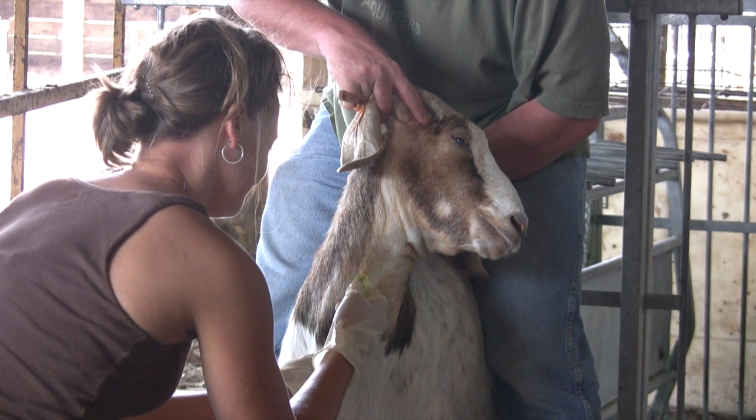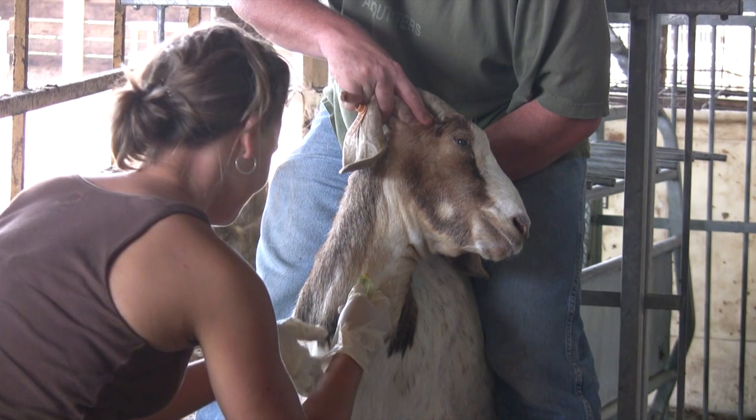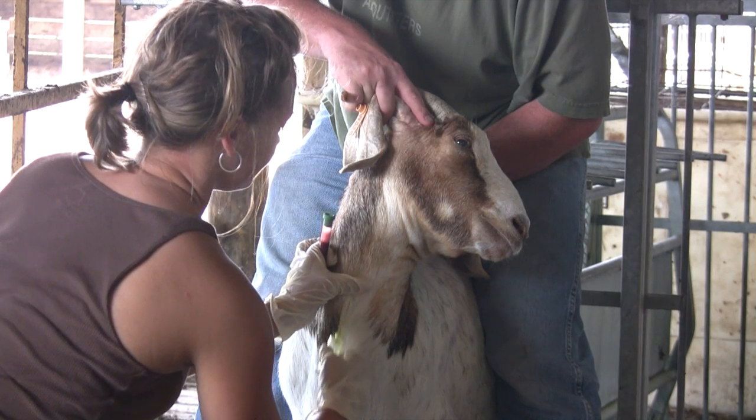Before removing the needle, be sure you remove your left hand, removing the pressure on the vein. Next, remove the vacutainer to prevent the loss of vacuum in the tube. Finally, remove the needle from the vein.